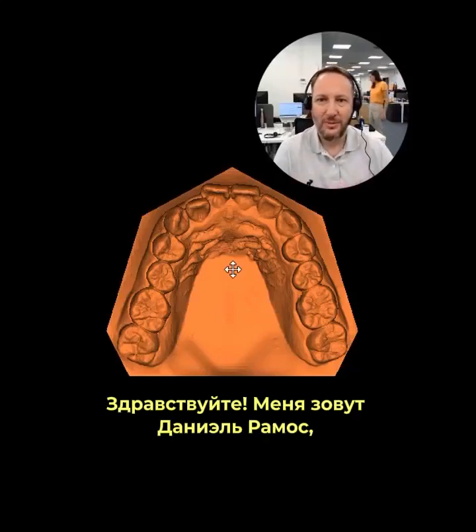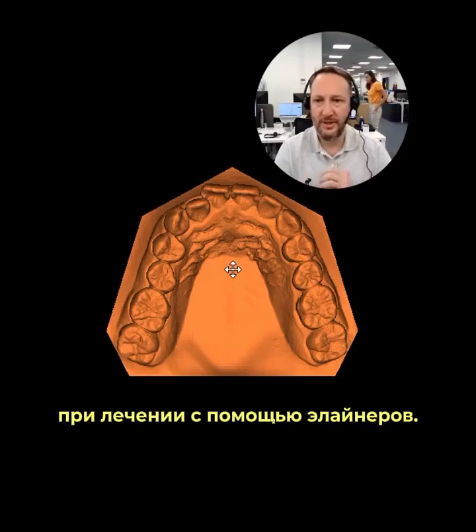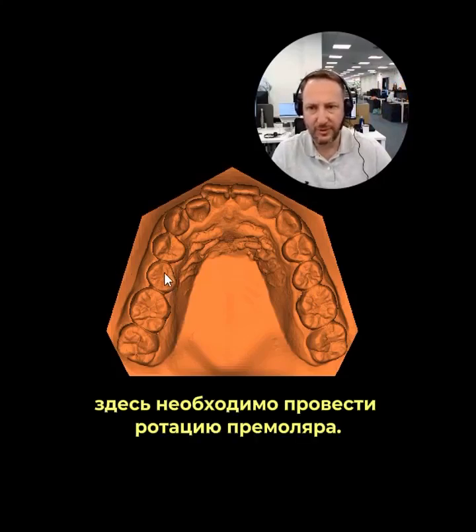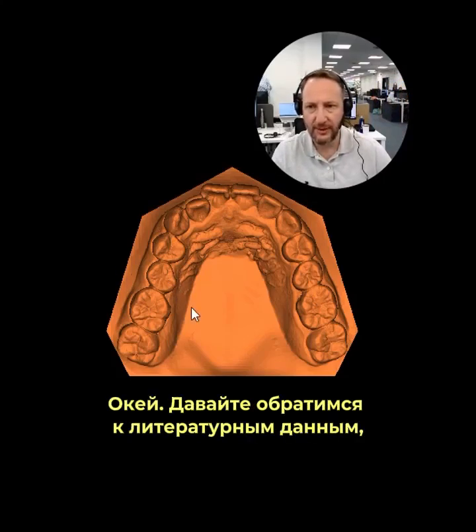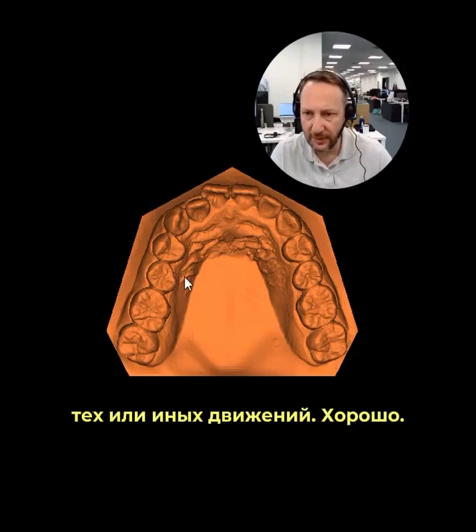Hello, my name is Daniel Ramos, and today I would like to discuss how we can improve the predictability for rotation movements with aligners. I'm taking this case as an example, and we can discuss this premolar, which is rotated, and we need to, of course, correct it. We need to do this rotation to move it to a better position.